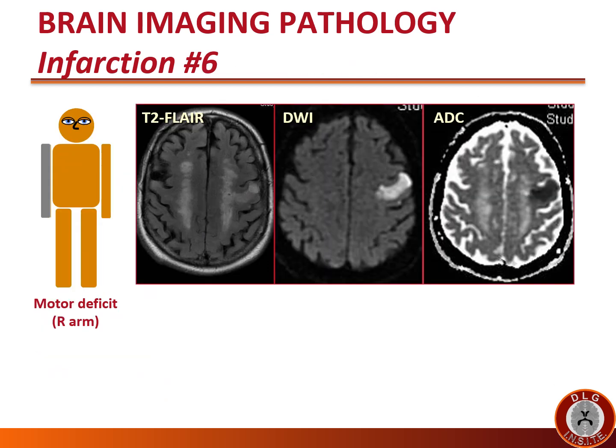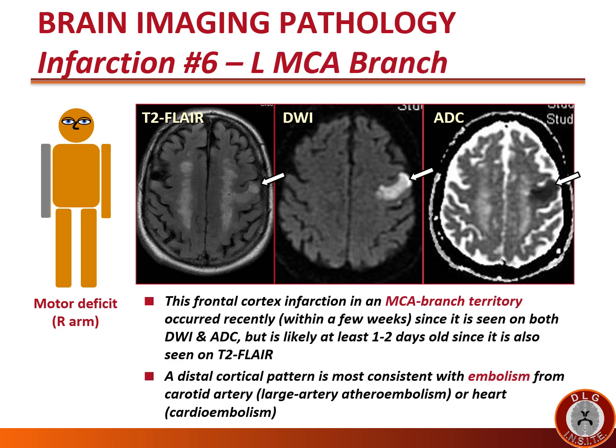This patient presented with right arm weakness, and we show his MRI scan images. The MRI shows a frontal cortex infarction in an MCA branch territory that occurred recently — within a few weeks — since it is seen on both DWI and ADC, but is likely at least one to two days old since it is also seen on FLAIR. A distal cortical pattern is most consistent with embolism from the carotid artery — large artery atheroembolism — or the heart — cardioembolism.